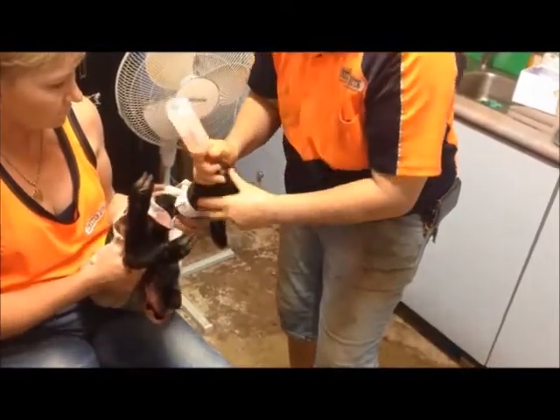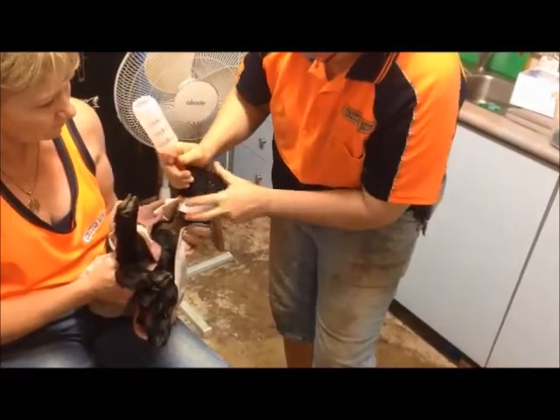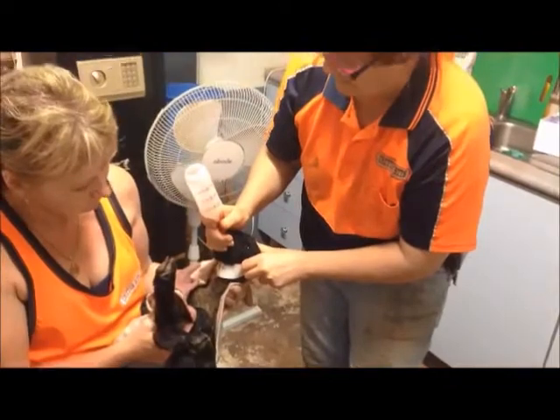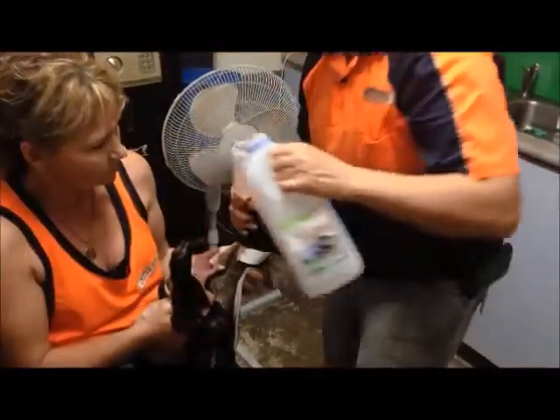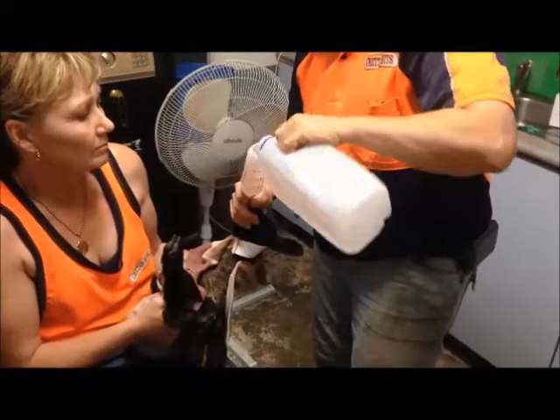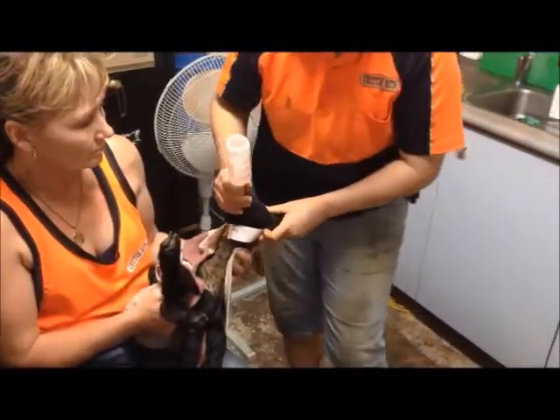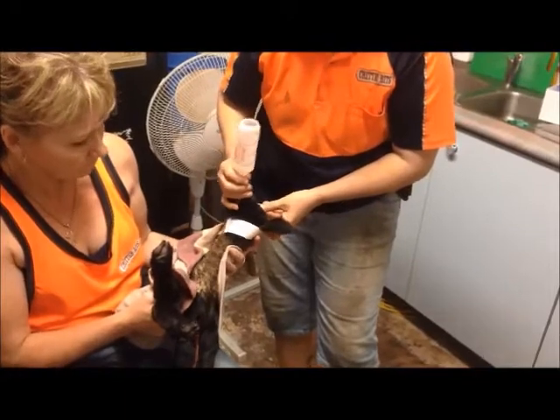All right, we'll just see how much that goes down — it's down to 30 again already. Now this is only for a lamb that's very depressed. I'll put him on the ground in a minute and you'll see. This little one hasn't had any fluid probably for a day or so, but it won't take much more — that'll be about the limit for a little one like this. You can see now she's quite listless, her little eyes are sort of half shut — she's a little girl.